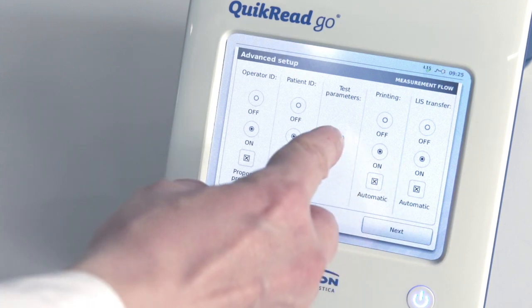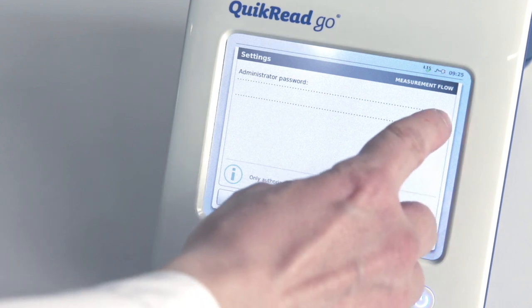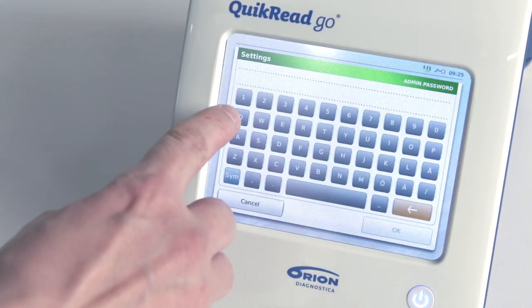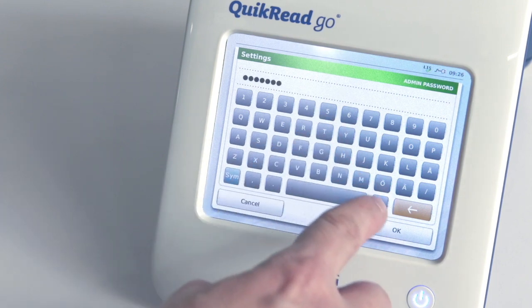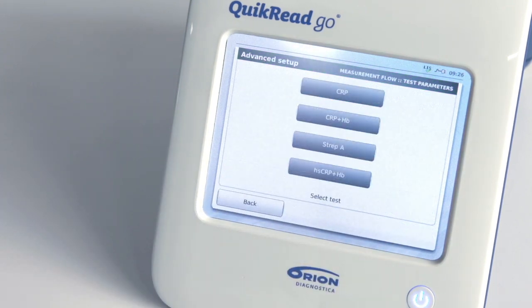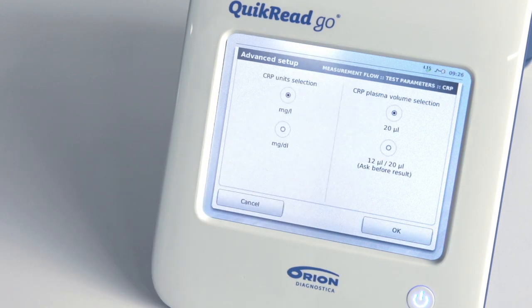Next, in the Advanced Setup, you can select test specific parameters. You will need an administrator password to access this menu. Touch the icon for keyboard and a virtual keyboard will emerge. The default admin password can be found in the user manual. Now you can select a test and set parameters such as the unit used for the results or the sample volume. All settings can be changed any time later by going back to the Basic Settings menu.